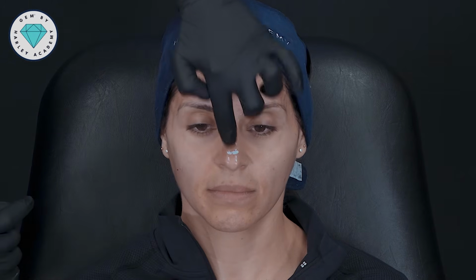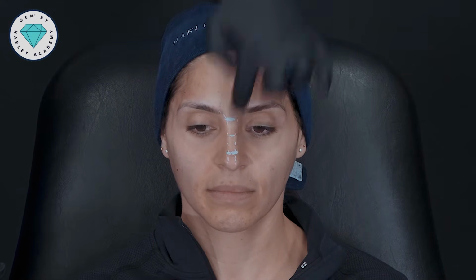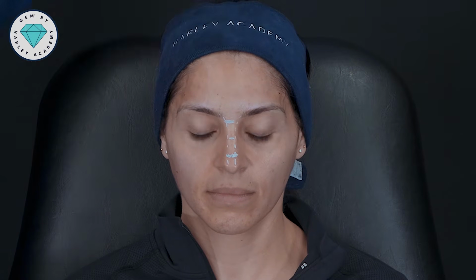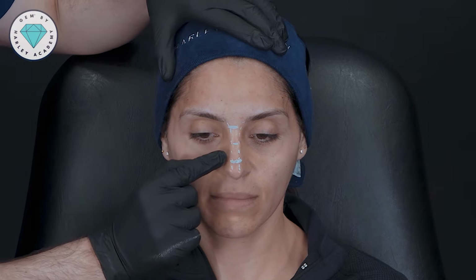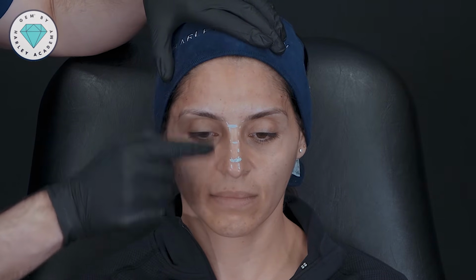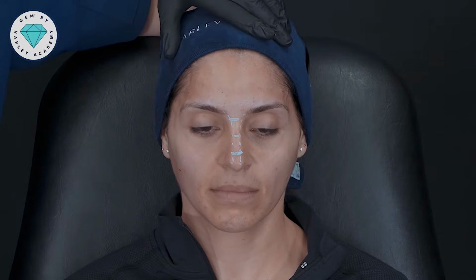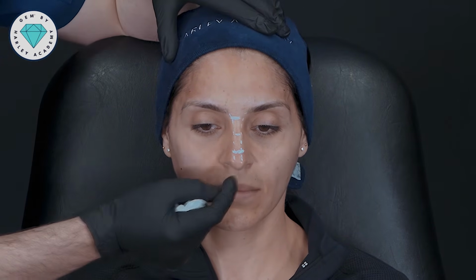When we get into the upper 70% of the nose, from this muscle where the nasalis muscle is upwards, we have our very narrow concentric 5 layers of the face. And so we want to be injecting deep underneath layer 3 to treat the upper 70% of the nose. That's where we generally will find the avascular plane of the nose. But around the tip and the septum, we have to be very careful, because we don't have a predictable way to interpret where the major arteries are going to be.